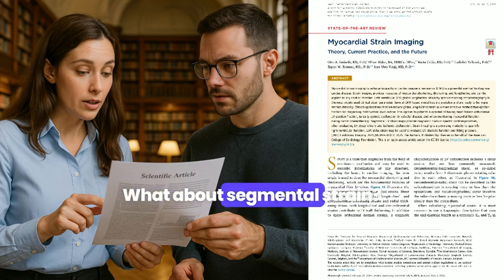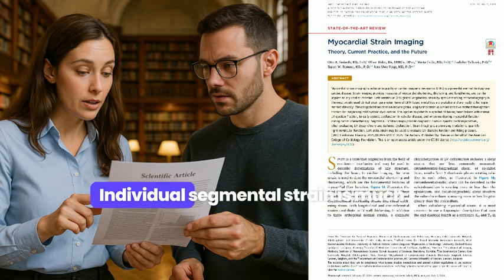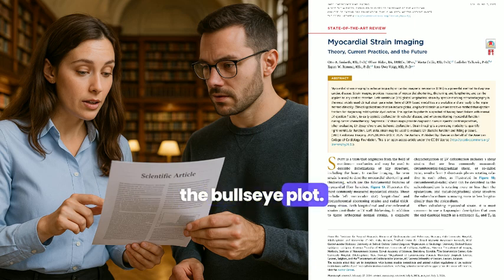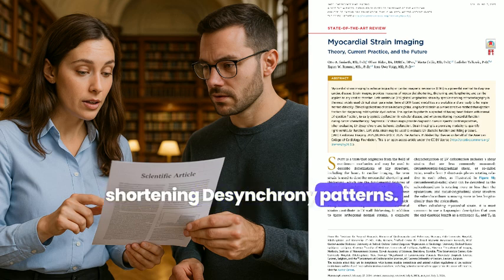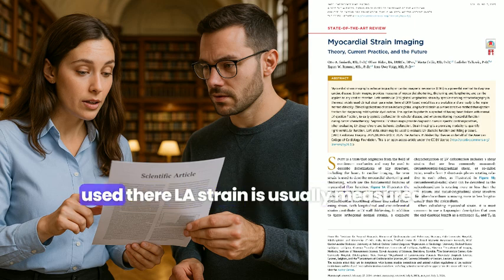What about segmental strain? GLS is reproducible because it averages many segments. Individual segmental strain is much more variable, prone to noise. So don't overinterpret a single weird segment. Look at the overall pattern, the bullseye plot, qualitative assessment, post-systolic shortening, dyssynchrony patterns. Those are diagnostically important. Moving to the left atrium, how's strain used there?